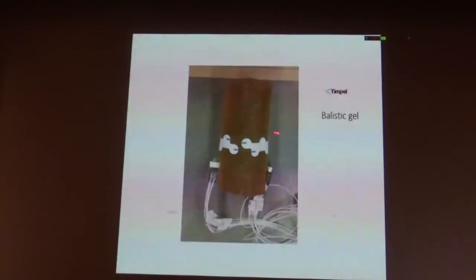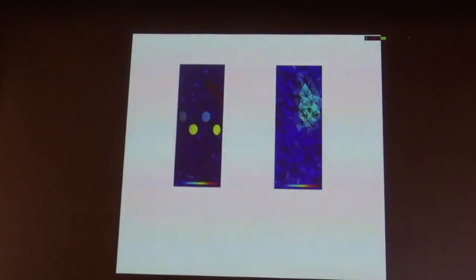What else? This anatomical information is leveraging us, the technology, a little bit further. Because now, a very smart engineer in the Polytechnic Institute had the idea of putting the electrodes in zigzag, like this. When you put the electrodes in zigzag, something very beautiful happened. Because suddenly we don't have only a slice, we have the reconstruction of the whole volume of the lung.